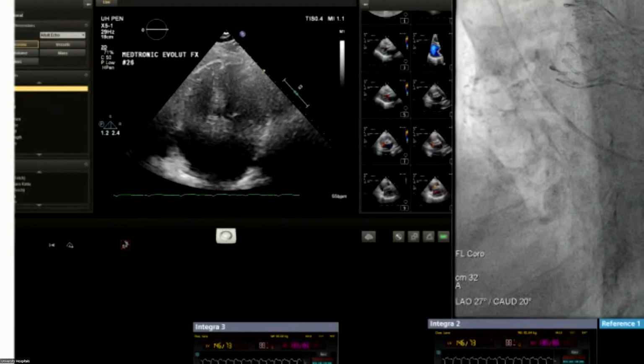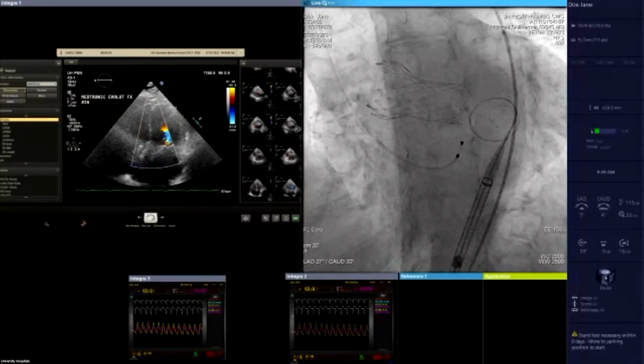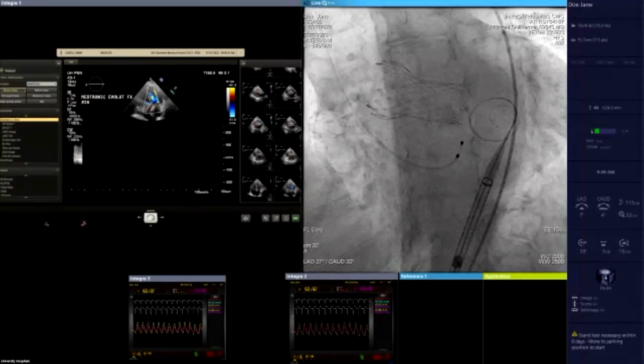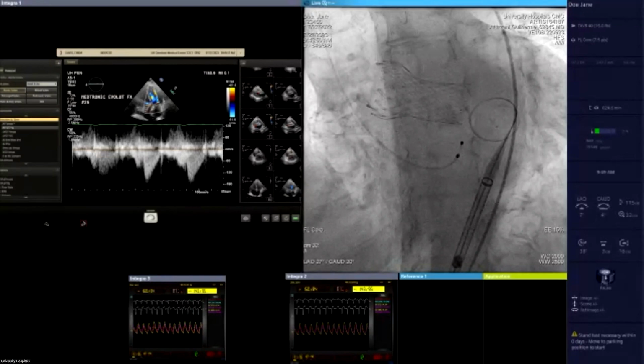So now, Steve, our echo sonographer, is doing our TTE. I think you guys talked about the transesophageal echo earlier today, as well as general anesthesia. We do all of our cases since 2014 under local anesthesia with no transesophageal echo guidance, and we feel very comfortable with that. How are you looking there, Steve?